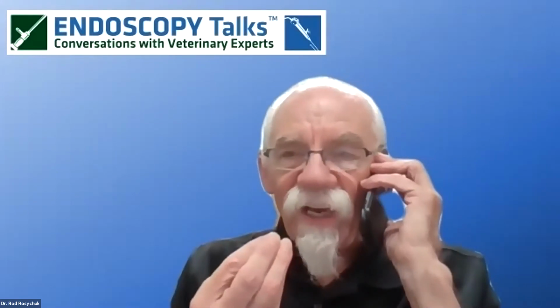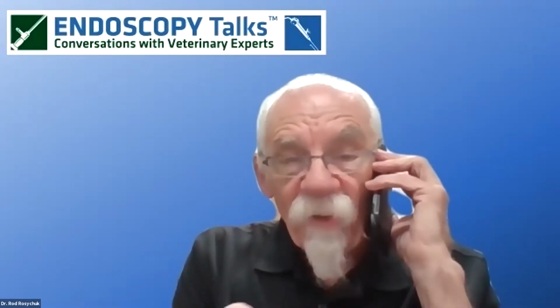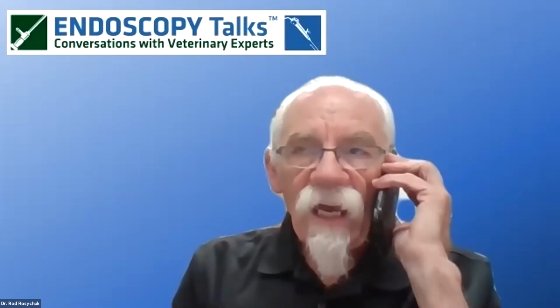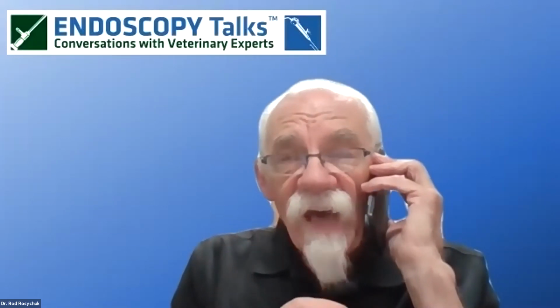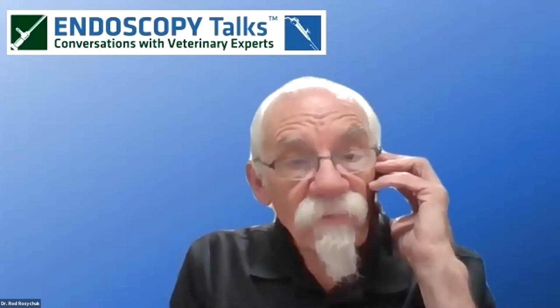If you can't visualize it, you can go too far with any of your instrumentation. As far as I'm concerned, the only time that is an issue is if you get into a very stenotic situation where, even with a video otoscope, you can't visualize that deeply. In a situation like that, if you can't visualize the tympanum, you use your best judgment as to how deep you think it may be. And if you're not sure, you stop. Then you work at treating the ear and opening up the canal. To be honest with you, a lot of times that's going to be enough, and the debris you might have left in that ear is not going to be an issue. You may get it out with flushing down the road.